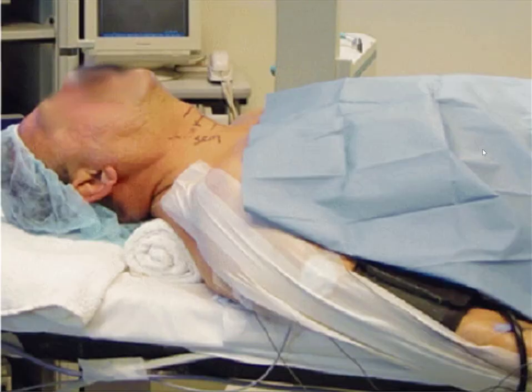Here is not the patient herself, but a very similar setup that I do. A roll posterior to the scapula. This roll is a little bit more superior than the scapula. The arms are taped down to the side to remove the arms from the x-rays and allow extension of the neck.